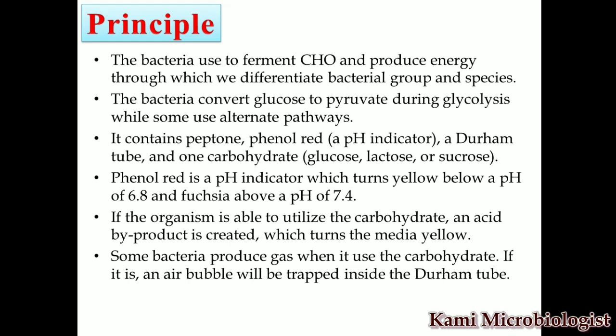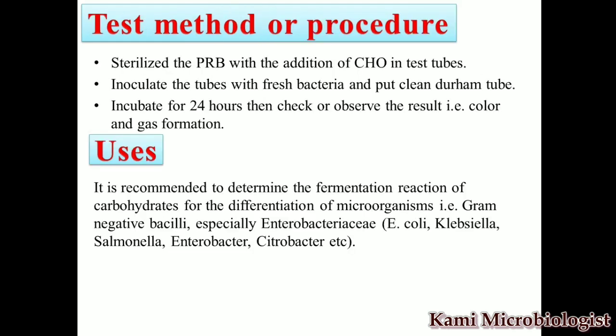The second thing is that sometimes the bacteria will produce gases, and these gases will be detected in a Durham tube. I will show you the picture of the result in the next slide. When the bacteria produce gases, they will be detected and trapped in the Durham tubes. So this is how the whole process works.